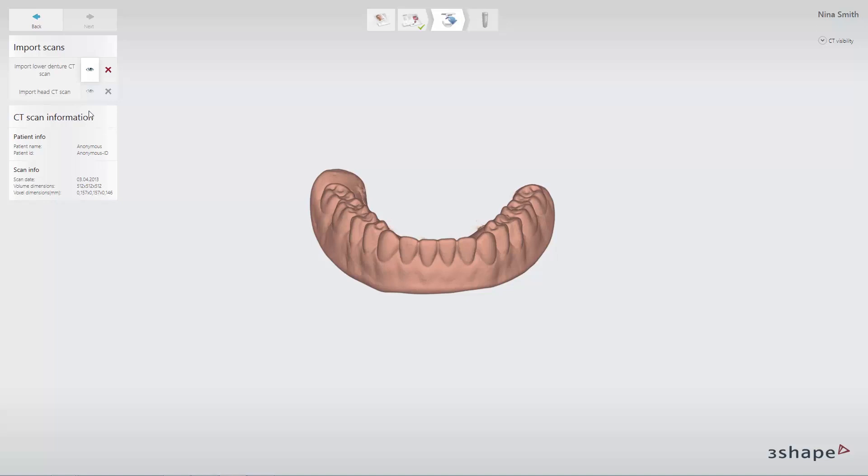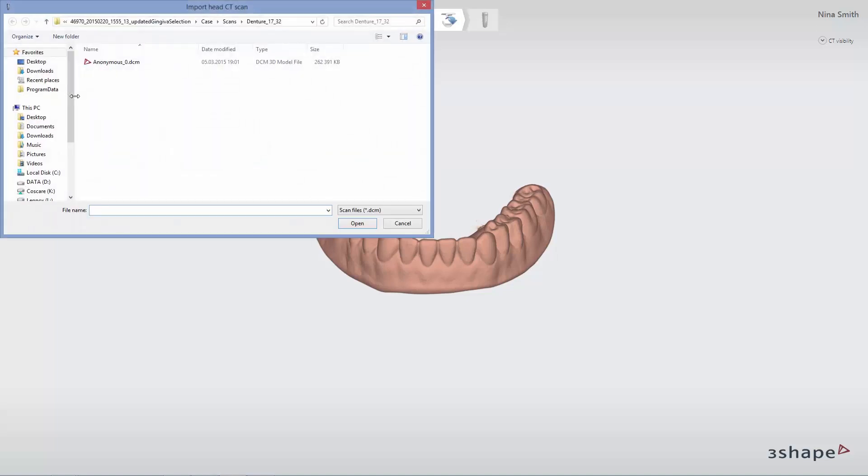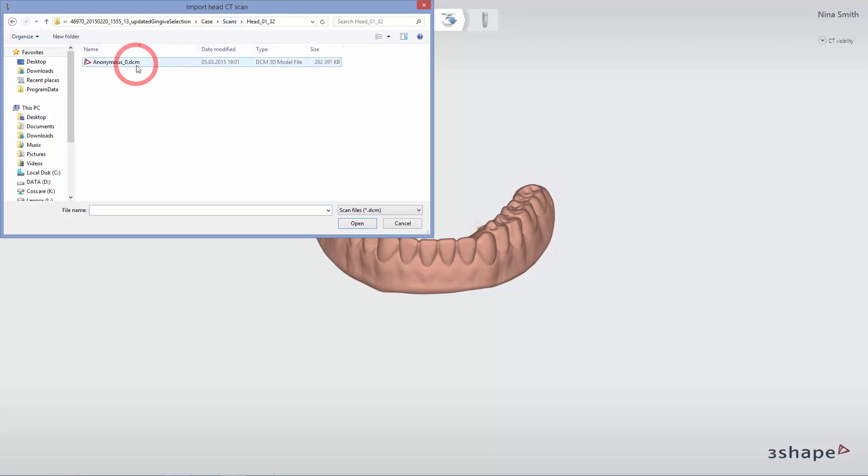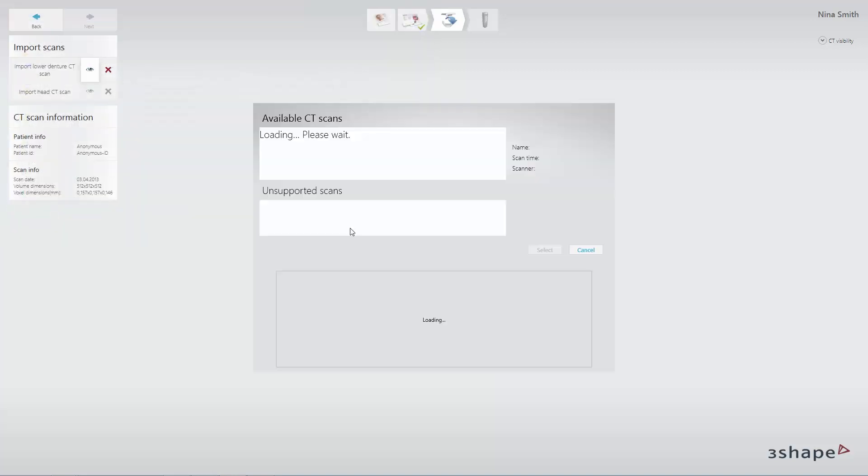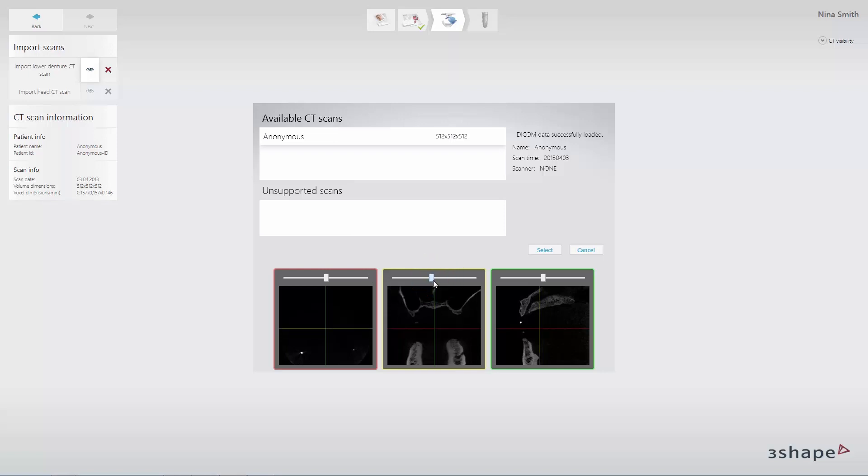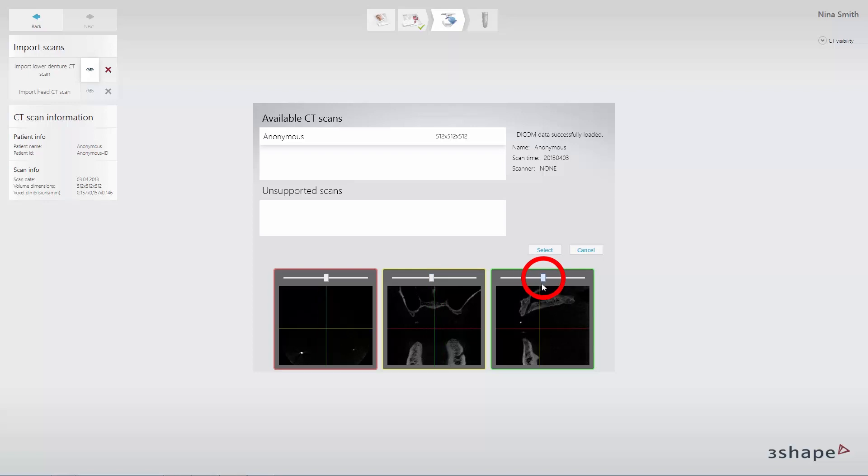Import the head CT scan the same way by clicking the Import Head CT Scan button.